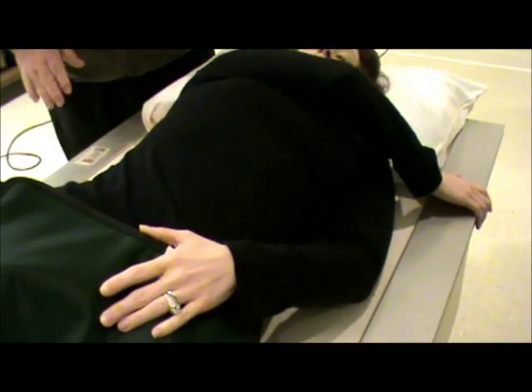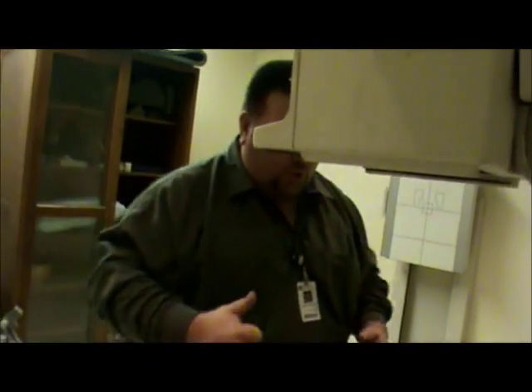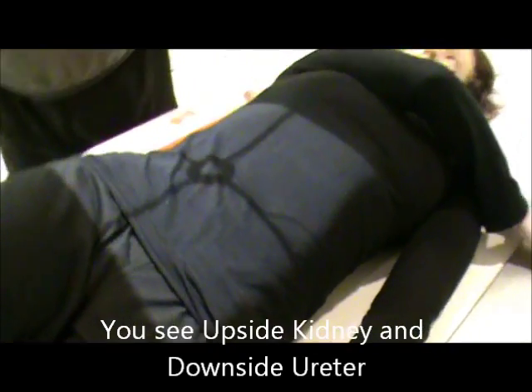This is about a 30-degree oblique. We want the patient to roll back just a little — we're trying to get the kidney and ureter away from the spine so we can see a little better. For centering, we go at the level of the crest and to the center of the patient as they're oblique. Collimation is to the IR borders. In the LPO position, we're seeing the upside kidney — which is the right — and the downside ureter. In an RPO, you'd see the reverse: the upside left kidney and the downside right ureter.